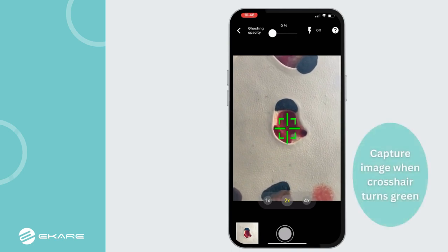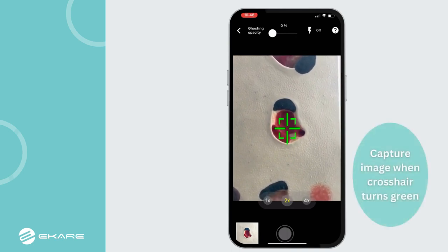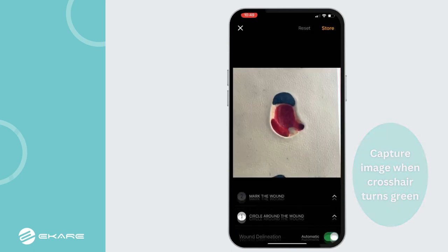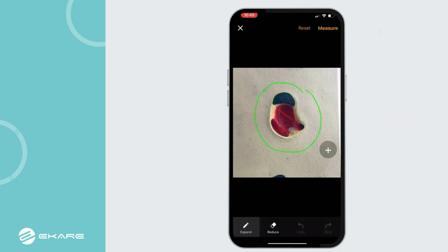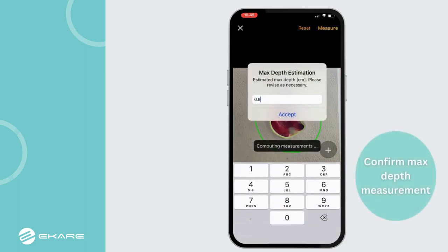Adjust the device positioning and capture the image when the crosshair turns green. Once the photo has been taken, draw a circle around the wound and swipe inside the wound, then select Measure on the top right.